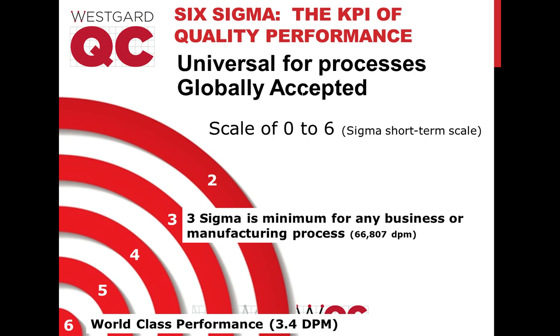If it turns out you have an instrument that's waived, but the sigmametrics are really, really low, I would follow the sigmametrics and say, I need to do more Westgard rules, I need to run more controls than what the manufacturer is recommending. Because it's better to be helping your patients with the appropriate level of quality than just maintaining the compliance and surviving an inspection.